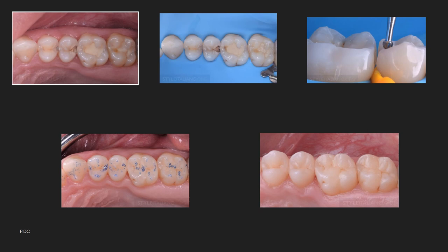First, shade selection: compare the tooth structure using a Vitapan shade guide and make sure the right shade is selected. Then check the contours and occlusion of the tooth before preparation. You should have an idea of how you are going to build up the tooth, including the proximal box and how to achieve proper contact and contour.